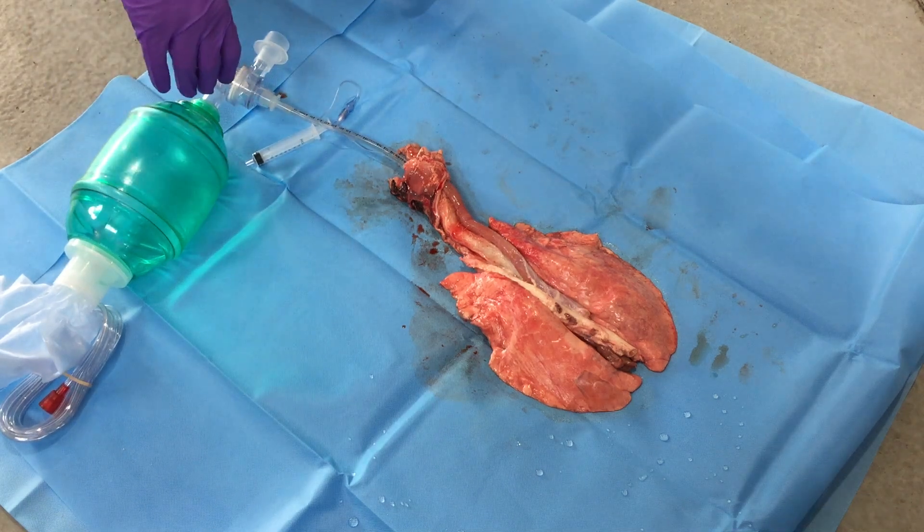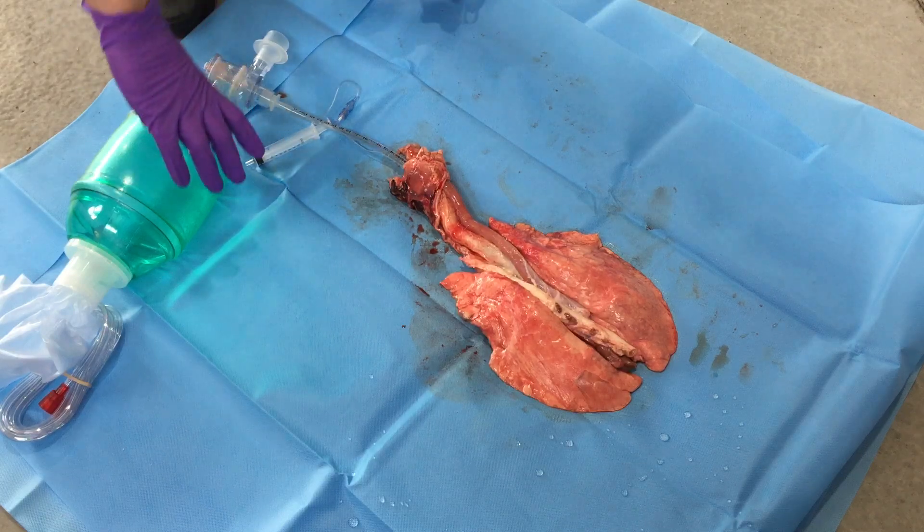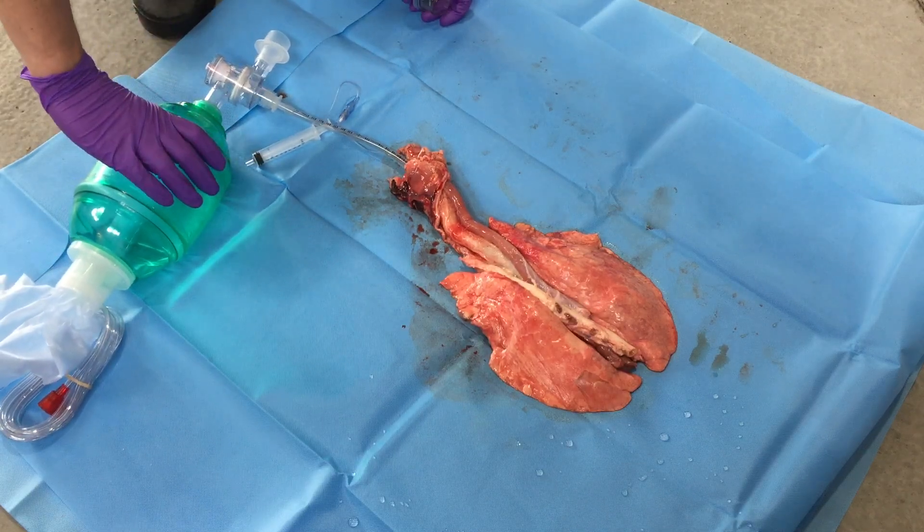In this quick video we're going to demonstrate BVM ventilation with and without a PEEP valve, and show you some of the benefits of using PEEP on someone's airway.